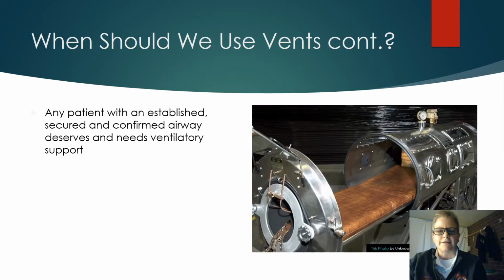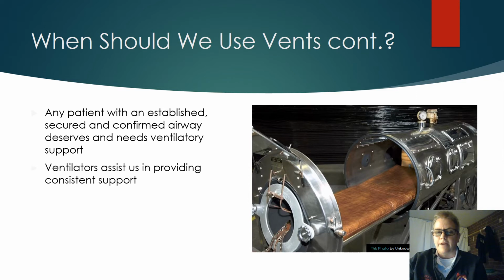Okay, so more reasons. Any patient, and we've talked about this, with an established, secured, and confirmed airway deserves and needs ventilatory support. So a vent support. It helps provide consistent support. We can manage their oxygenation, their PEEP. We can look at their end-tidals and decrease or increase respiratory rate, increase or decrease tidal volumes based on some good science. So we really should use them.